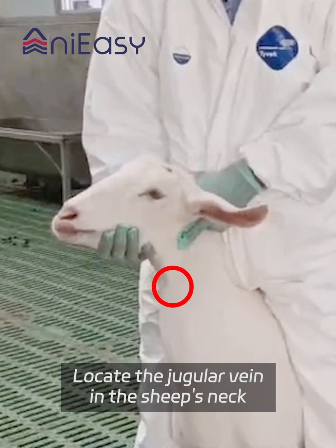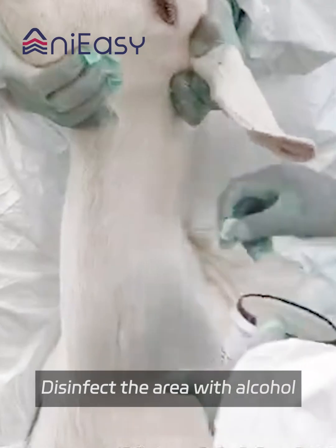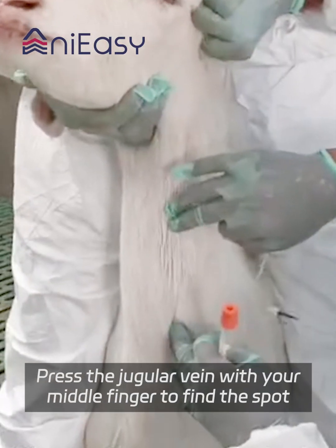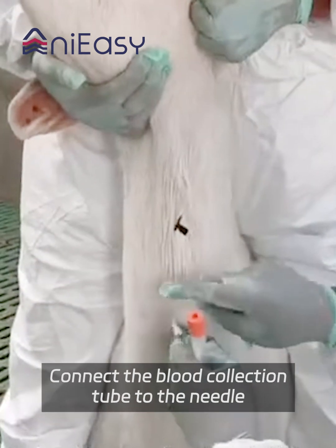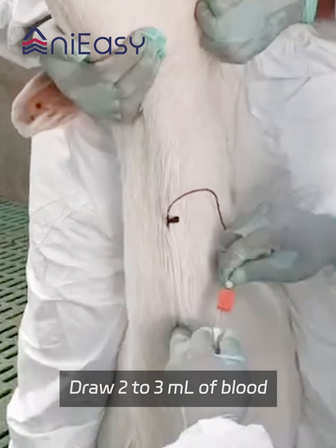Locate the jugular vein in the sheep's neck. Trim the wool before drawing blood. Disinfect the area with alcohol. Press the jugular vein with your middle finger to find the spot. Insert the needle at a 30 to 45 degree angle. Connect the blood collection tube to the needle and draw 2 to 3 milliliters of blood.